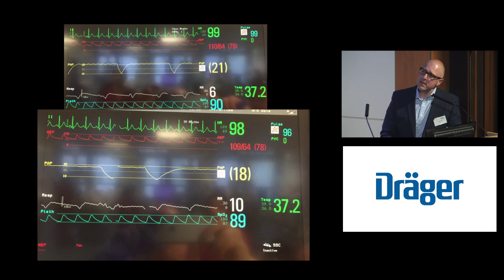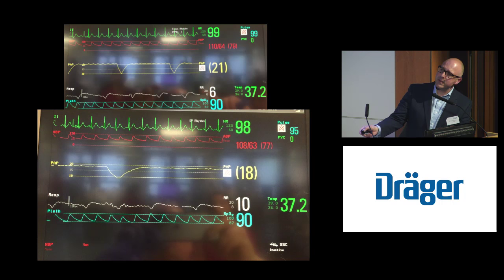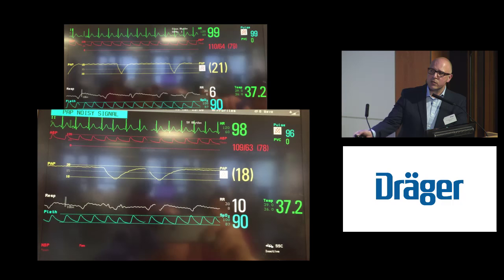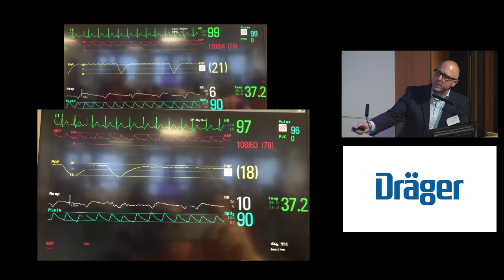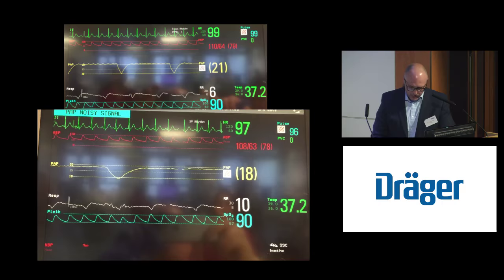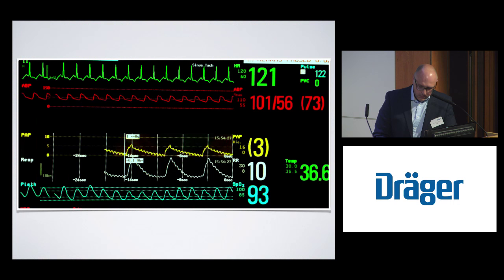That is an idea of esophageal pressure. So you can see here, this is the esophageal pressure, and this is during APRV. And why do we do that sometimes? Sometimes we don't know whether what we are doing with the ventilator will be transmitted straight to the lung. You can see here that the transpulmonary pressure is only 10 centimeters of water, but obviously the P high is 28 over zero. And it is quite useful to see that you're not transmitting all that pressure to the lung.